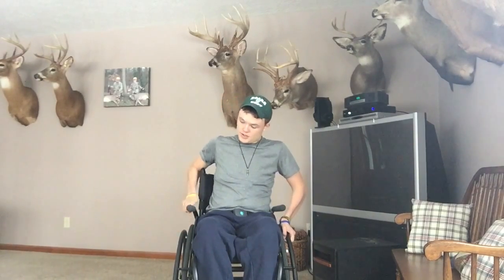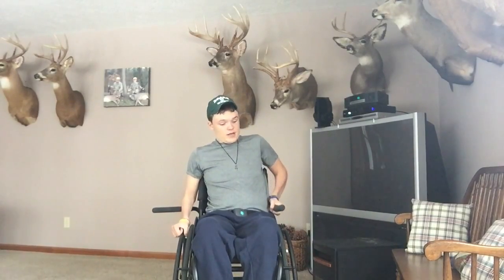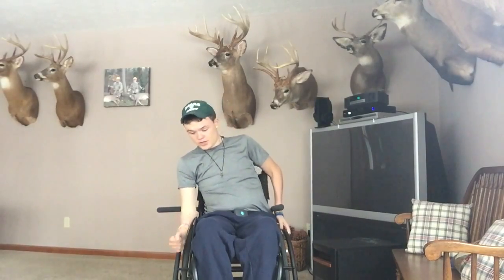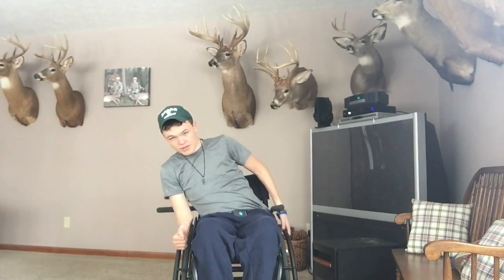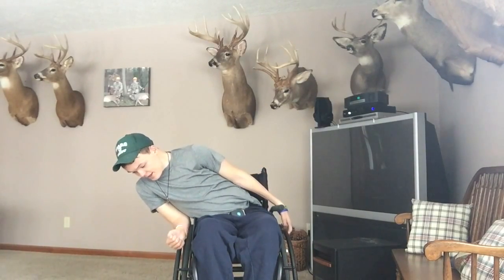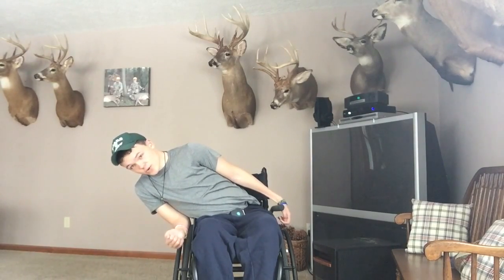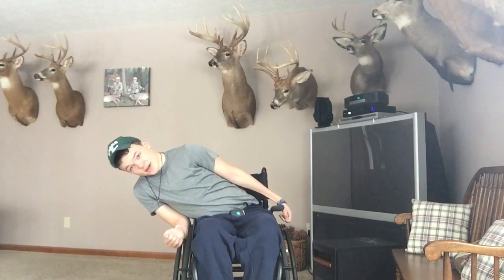The second way to do pressure reliefs in a manual chair, which is probably the most common way, is to first get this armrest out of the way, and you want to hold on to either the push rim or the other armrest that is on the wheelchair, and use this arm to put on your push rim or tire and lean over like this as far as you can. This will relieve pressure on one side, and you want to hold this for probably 30 to 90 seconds.